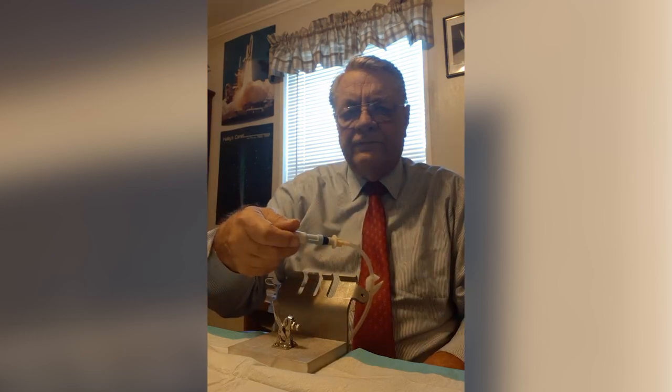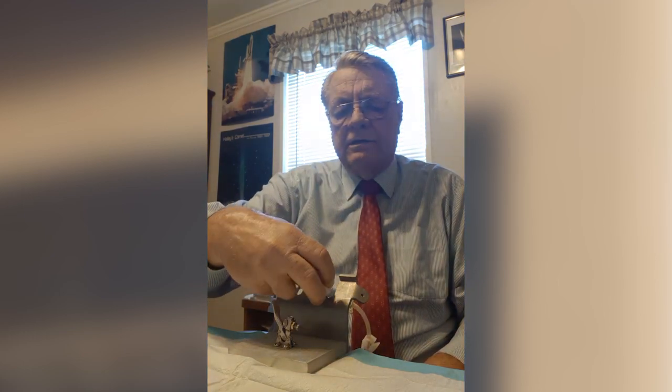Now to open the valve it's very difficult with one hand, but if you place it in here and go counterclockwise the valve opens easily.